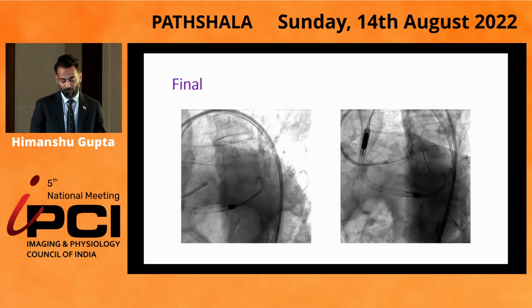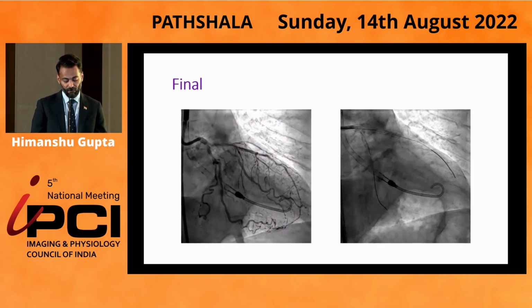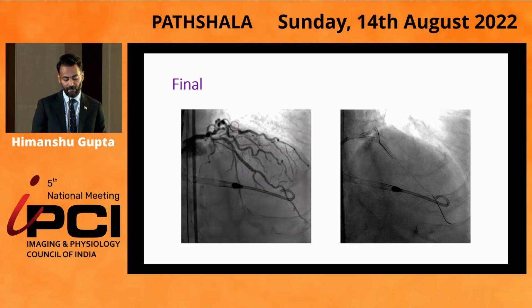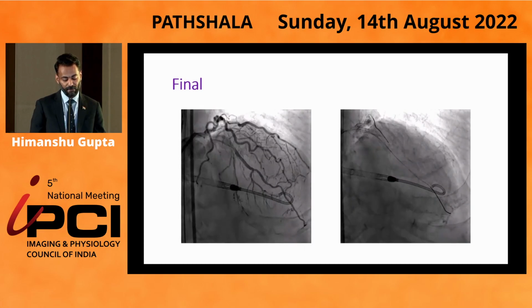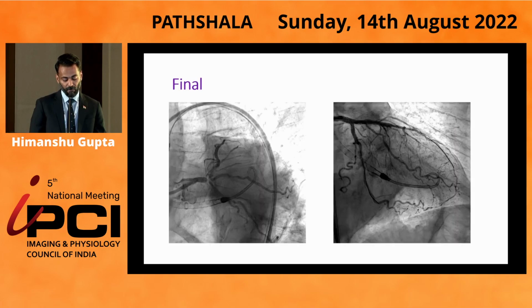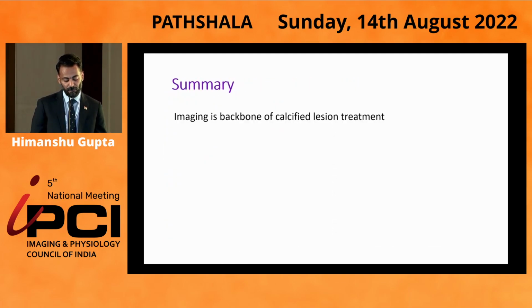So we have an appropriate angiographically and imaging guided result with a good result in the left main and ramus. And in the LAD, we have a very good result, very nicely expanded stents. The patient did fine and was discharged 3 days later.